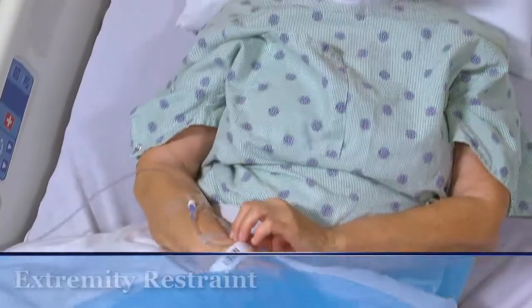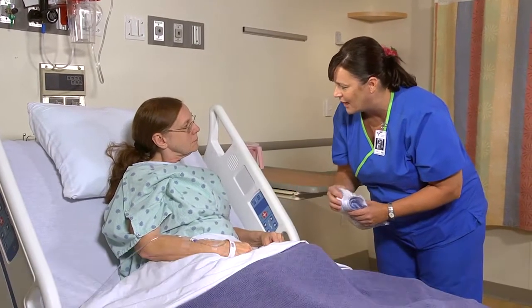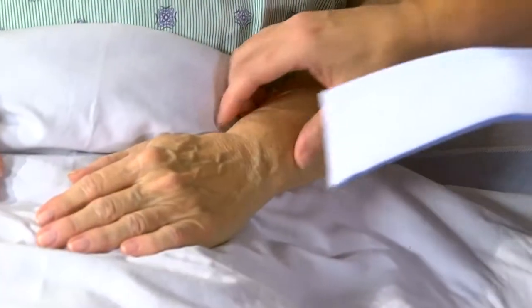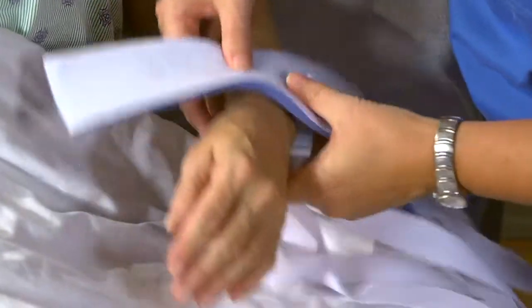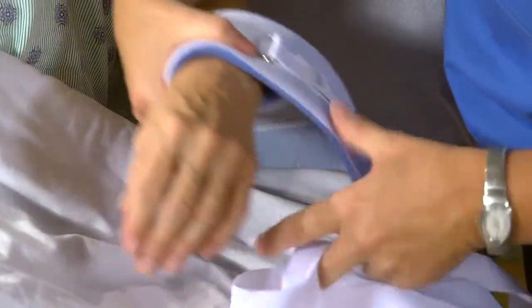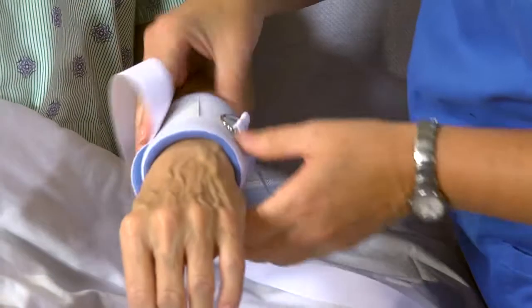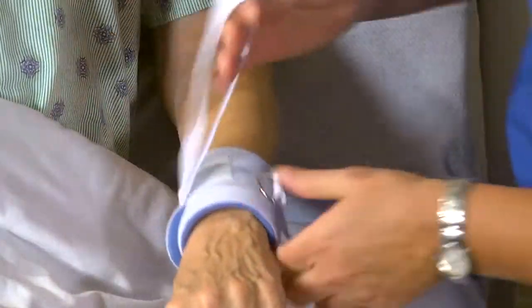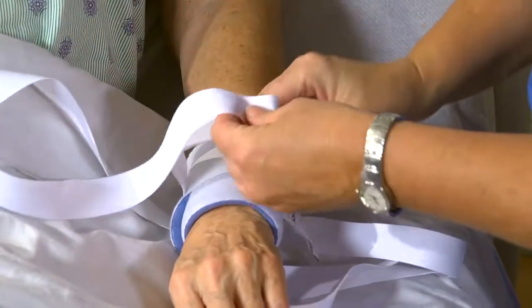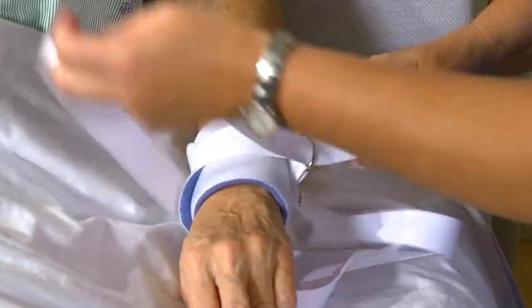An extremity restraint is a prescribed device made of foam padding that's applied to the wrist or ankle. To use this kind of restraint, wrap it around the limb with the soft part facing the skin. Use the Velcro straps to secure the wrist device. Make sure it is snug but not tight. To check the fit, make sure you can slip two fingers between the restraint and the patient's wrist or ankle. Then secure the strap through the D-ring.